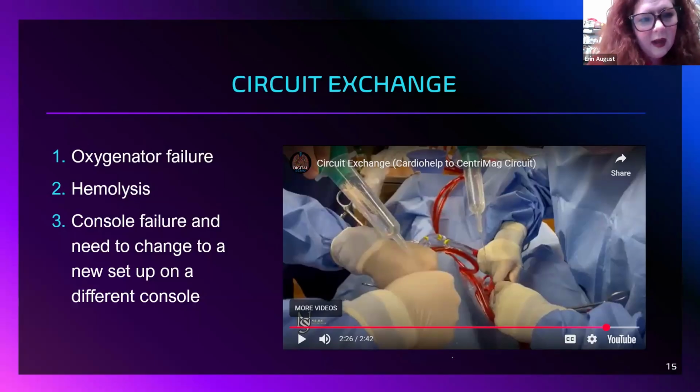Again, I gave them homework. I would give them a piece of tubing with a 3/8 connector to do this, and then clamps so they could get used to and build the strength of their hands, so that they're able to clamp on tubing. Because all of us that have had to do these circuit changes, just like this one, we all know the viscosity of the fluid in the tubing also changes things. Clamping on saline or plasma-lyte is different than clamping on blood. So, all these things are really good to help build everybody's skills for success.